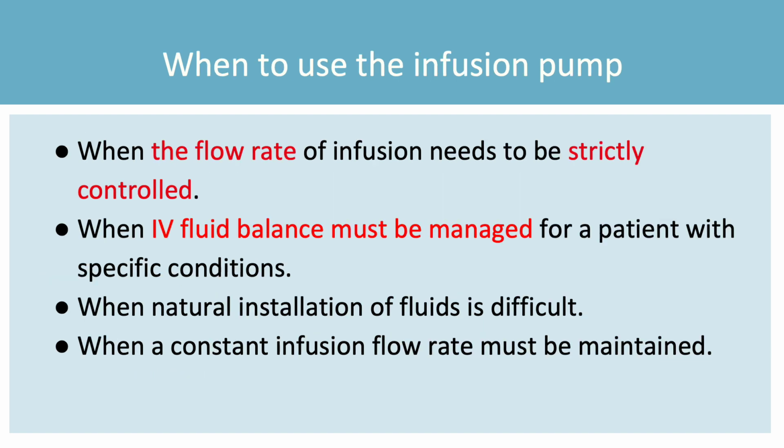Now we will explain when the infusion pump should be used. Firstly, the infusion pump is used when the infusion flow rate needs to be strictly controlled, such as for chemotherapy, vasopressor or antihypertensive drugs, and total parenteral nutrition, so-called TPN.